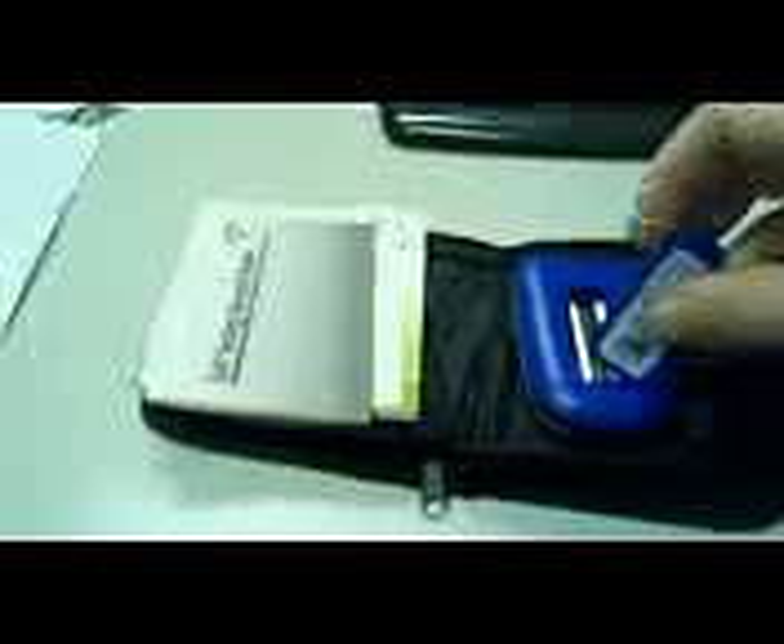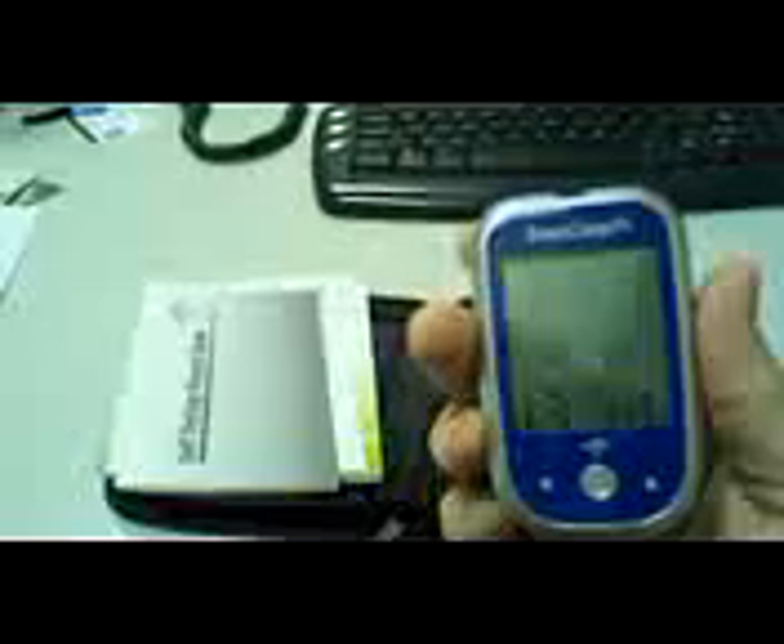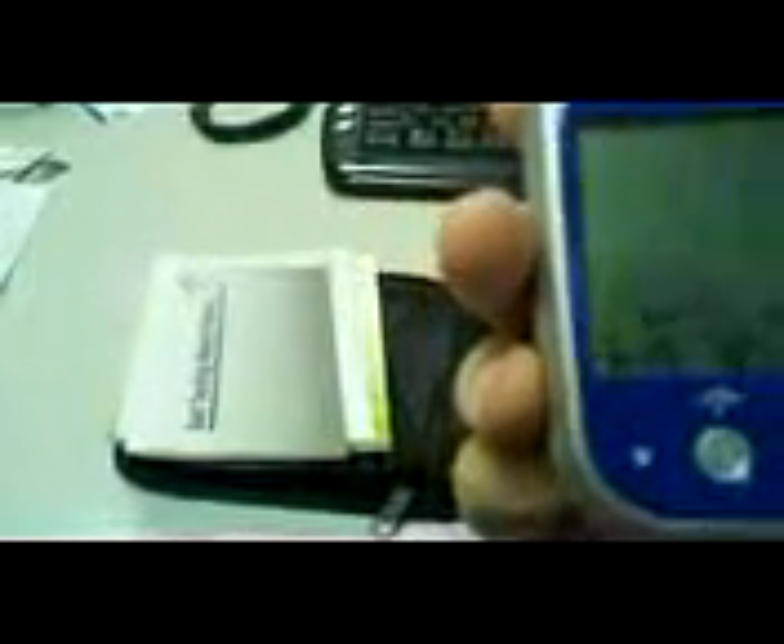It takes just two double-A batteries, which is nice, and it comes with them when you purchase the machine. It does have technical service information on the back, and you can call us any time. Let me turn it on — I'll hold that down. You can see it shows the time stamp and the date, and it comes on very quickly. You put the test strip right in there and it reads in less than 10 seconds.